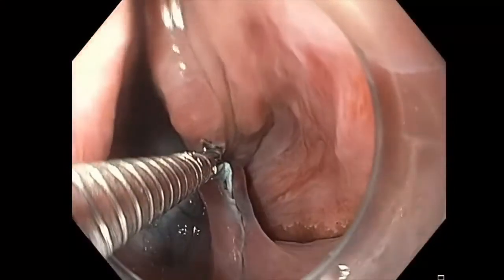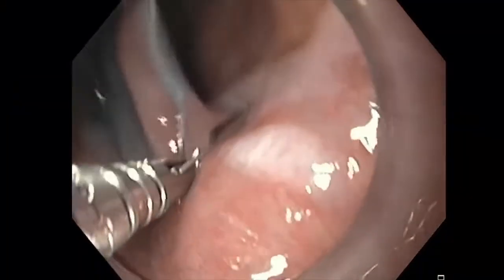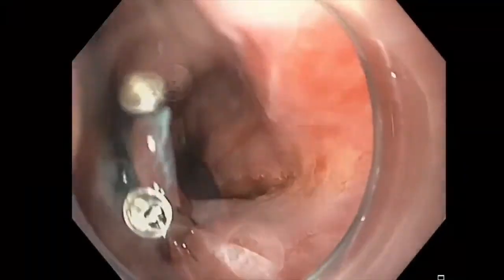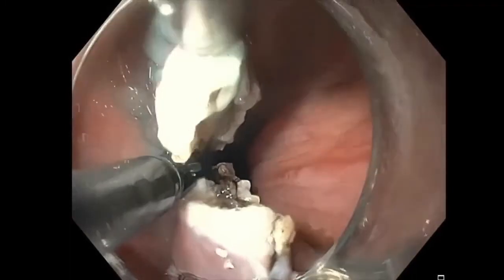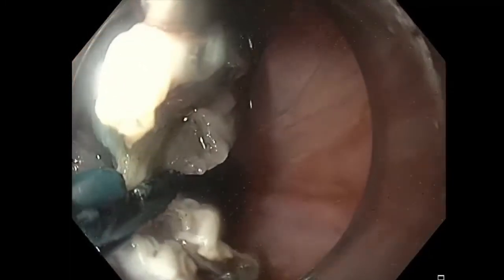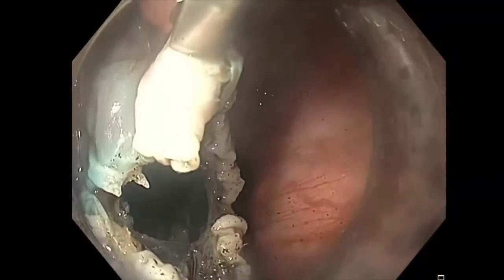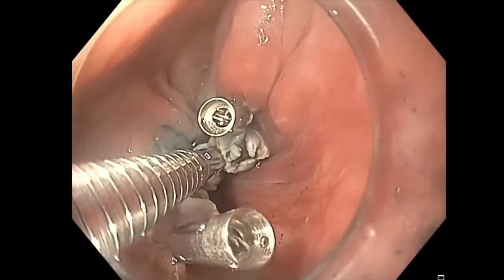The large residual mucosal flap is stabilized with placement of through-the-scope clips. Here we placed one clip at either end of the mucosal incision. The mucosa in between the two clips is then transected, allowing a wider communication between the diverticulum and esophageal lumen. This is carefully performed sequentially until the base of the diverticulum is reached, as appreciated here. Complete closure is then obtained by sequential clip placement across the entire mucosal defect.